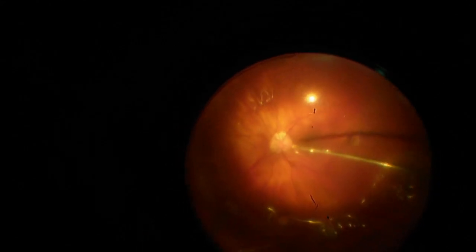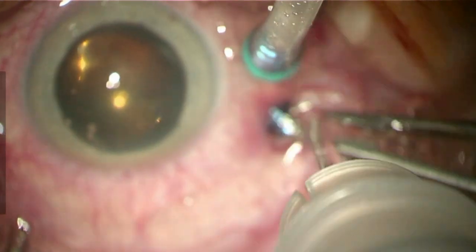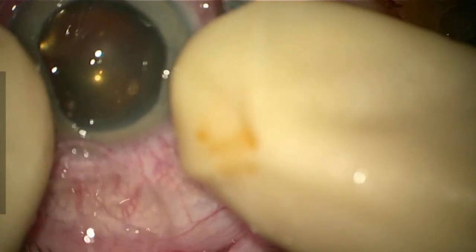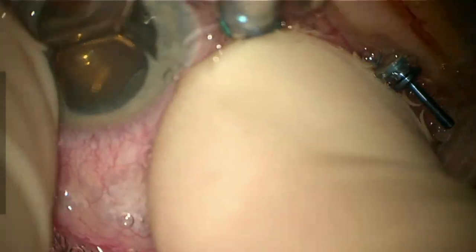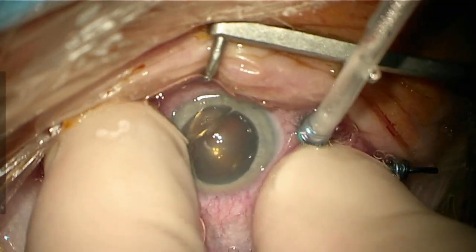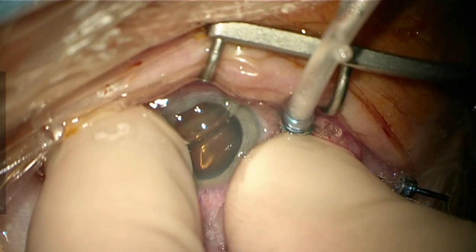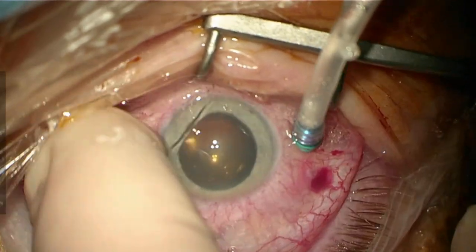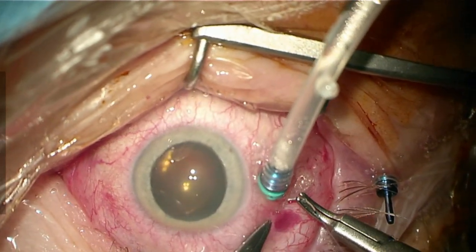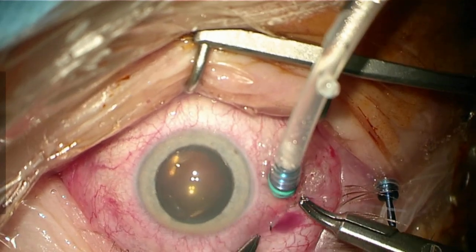Once our laser treatment is complete, we can finish our fluid-air exchange. We will aspirate the remaining fluid and now perform our air-gas exchange. I believe we used C2F6 gas. Since this was a first vitrectomy, it is usually relatively watertight, but in myopies, this is sometimes not the case. Indeed, in this patient, the scleral thickness might have been too thin, making it insufficiently watertight despite good tunneling. Therefore, we sutured our sclerotomies.